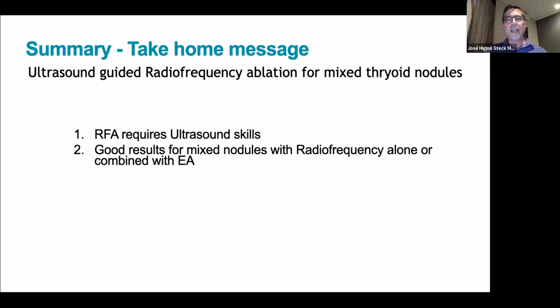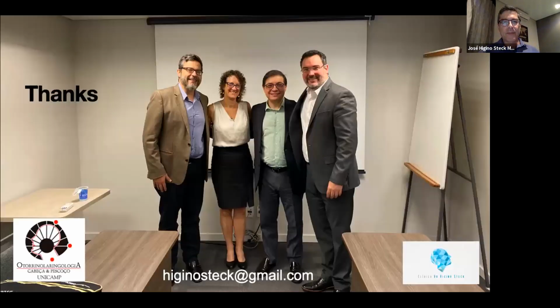And the message that I want to take home is that RFA requires ultrasound skills. It's the most important, it's the sine qua non, like Lisa said. And good results you can achieve from mixed nodules with radiofrequency alone or combined with ethanol ablation when it is indicated. Thank you.